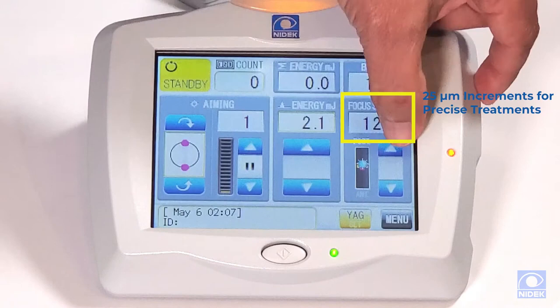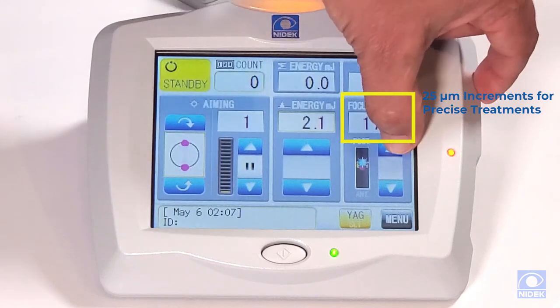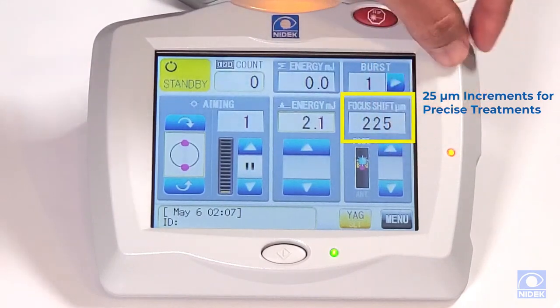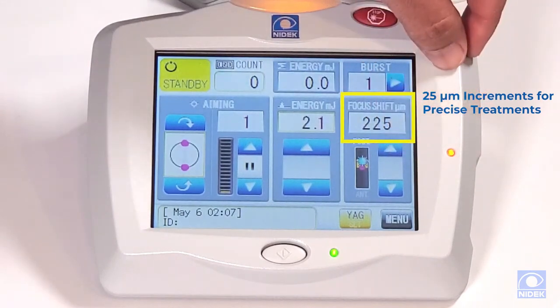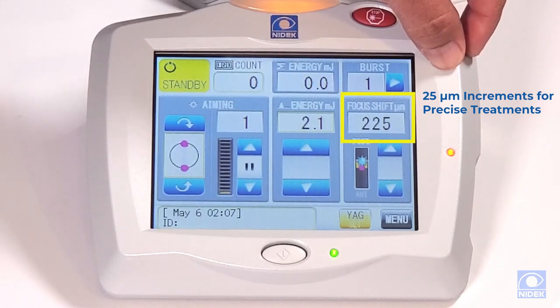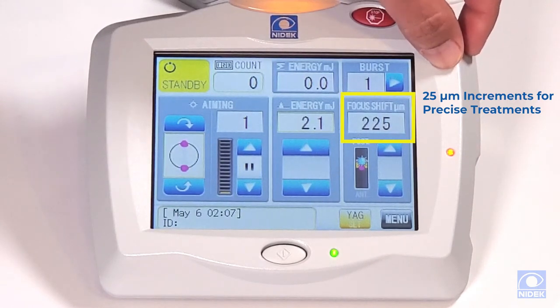The default offset is 25 microns. We can change this to 500 microns anterior or 500 microns posterior in 25 micron steps.